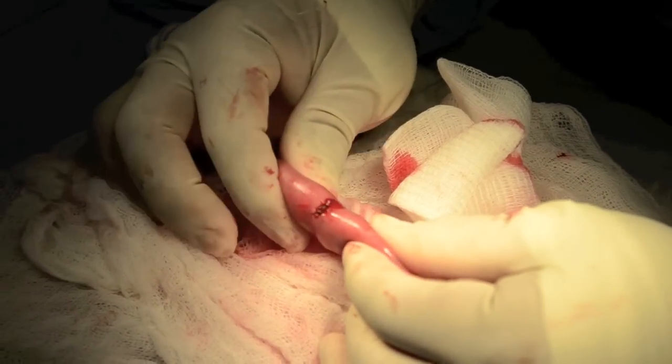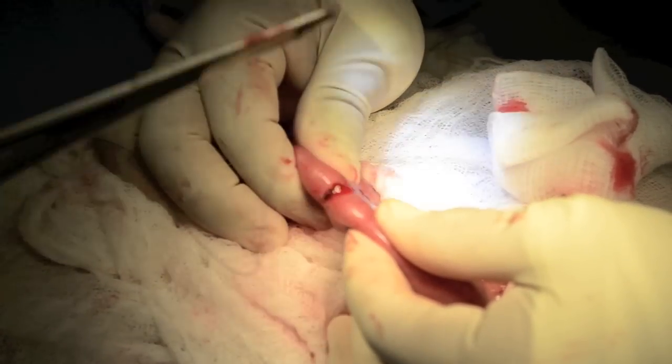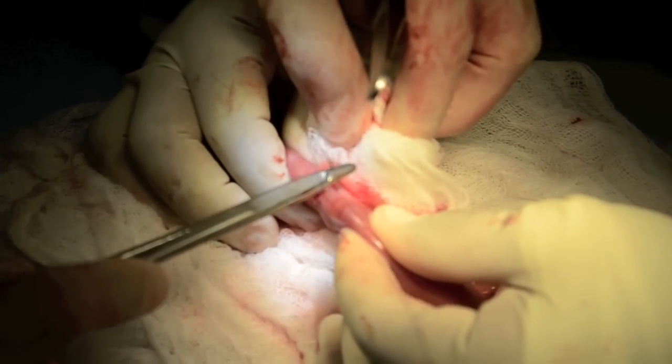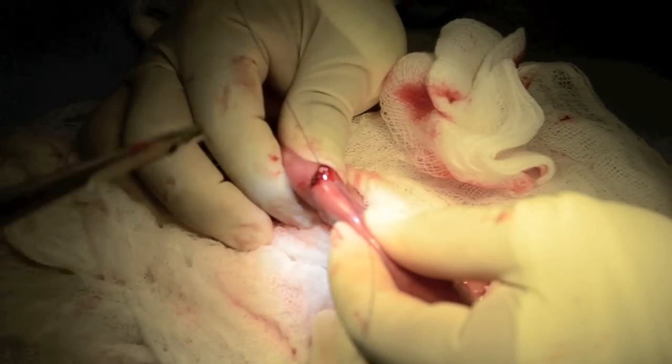On occasion, the suture may cut into the seromuscular tissue. That is okay — it can be tightened and left in situ. But sometimes the operator may feel more confident by substituting a second suture over that one.